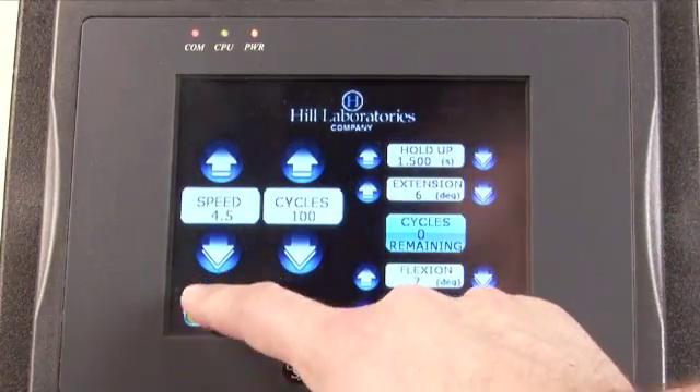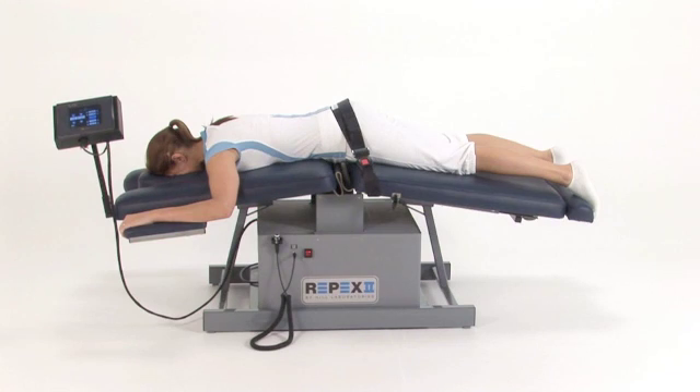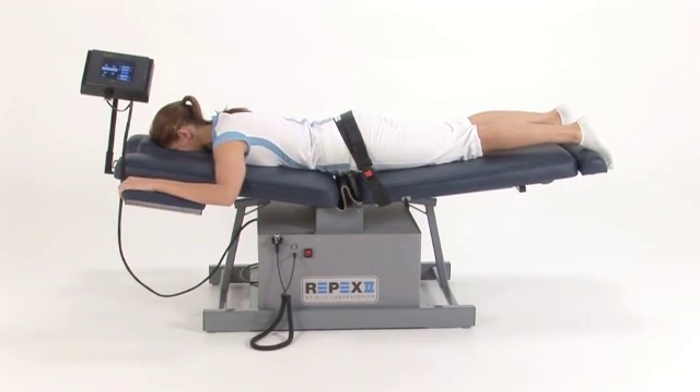When you are ready to start the treatment, press the run button. The table will then begin the treatment, and the cycles will count down on the touch screen display.